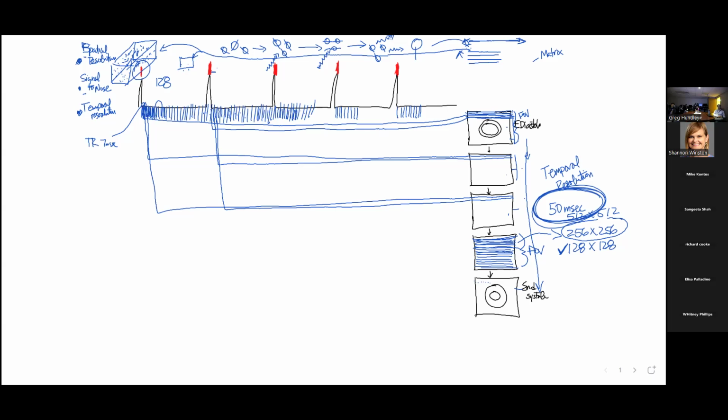When it does that, the computer goes back and looks for these triggers. It looks for these guys, and then it reorganizes all these little lines that you've captured based on the triggers, so that it can then reconstruct those pictures.